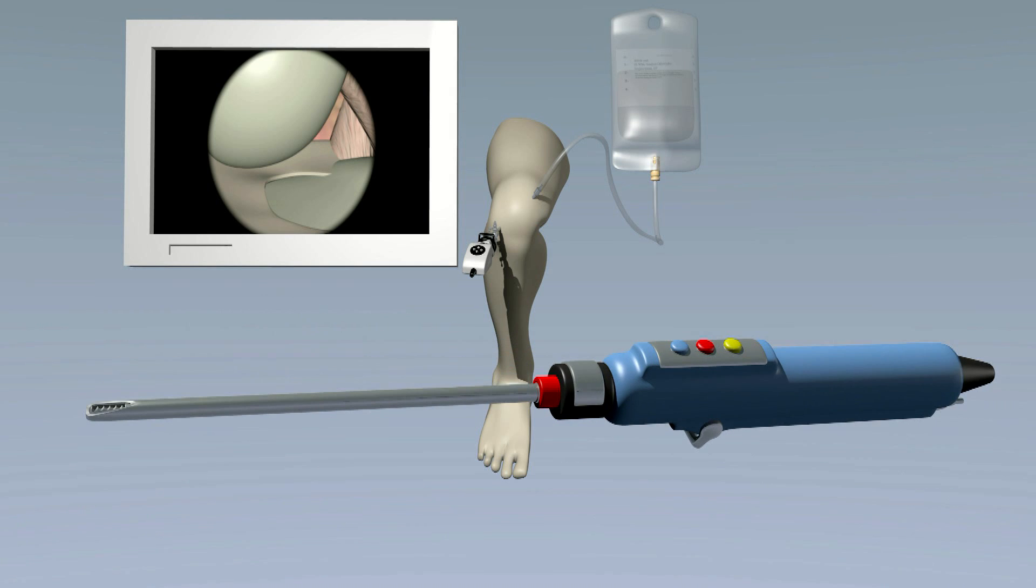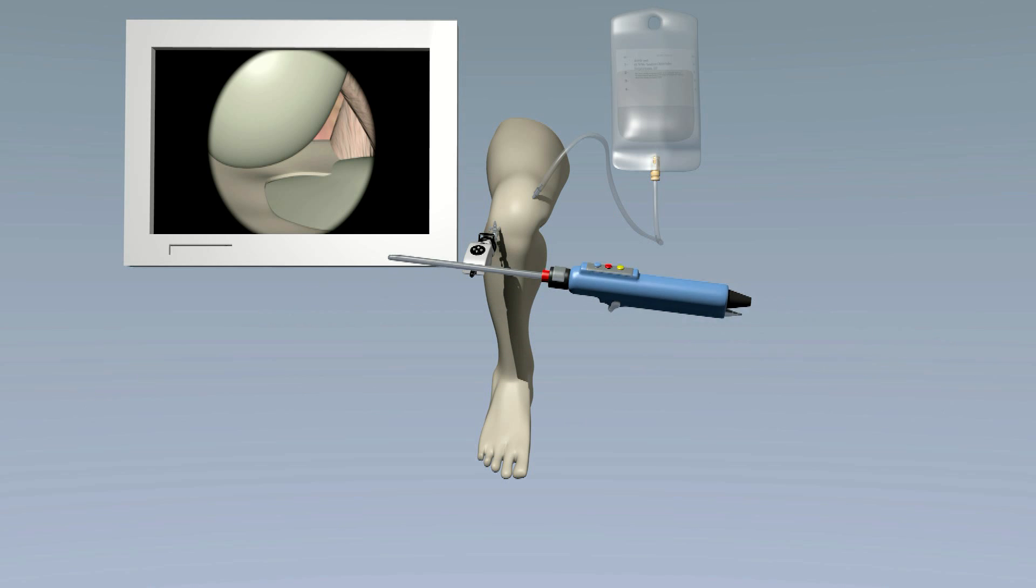One of the most commonly used instruments in knee arthroscopy is the electric shaver. A shaver has tiny rotating teeth that gently shave away unwanted cartilage and joint tissue.